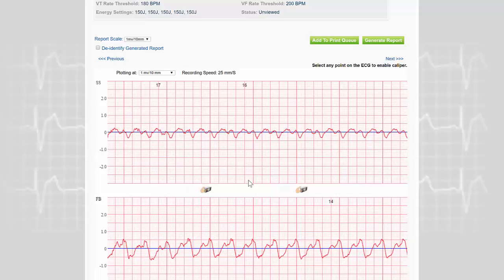But there is a major difference with an implantable defibrillator, since the interaction with the patient is possible. The patient can stop the delivery of the therapy if he is still conscious. That explains why the rate of inappropriate therapy in case of supraventricular tachycardia is really limited with this kind of device, because since the patient will remain conscious, he will stop the delivery of the therapy.